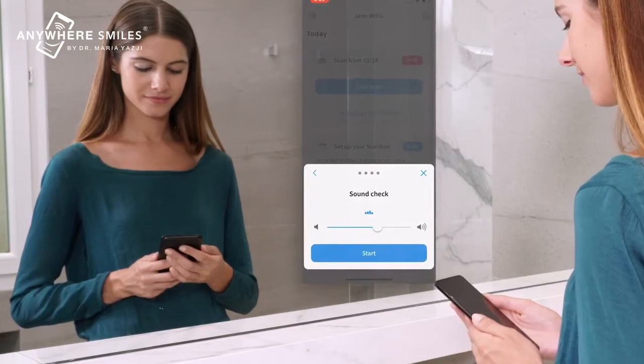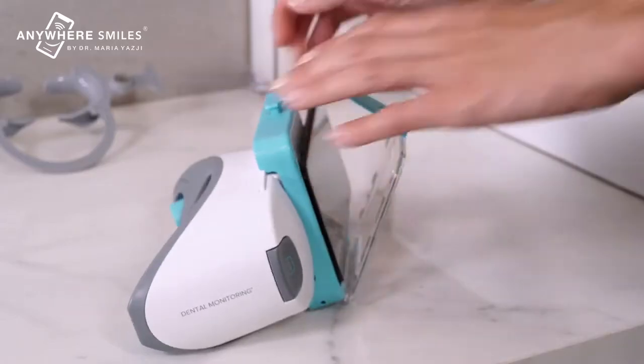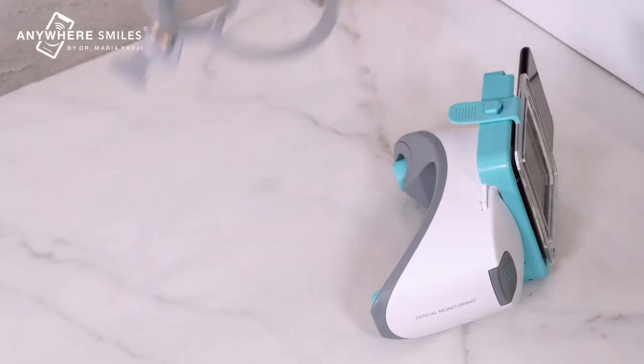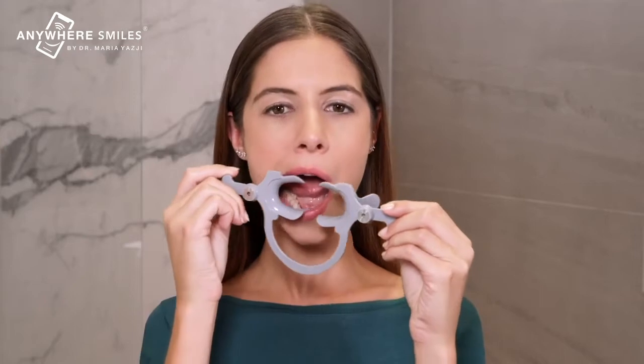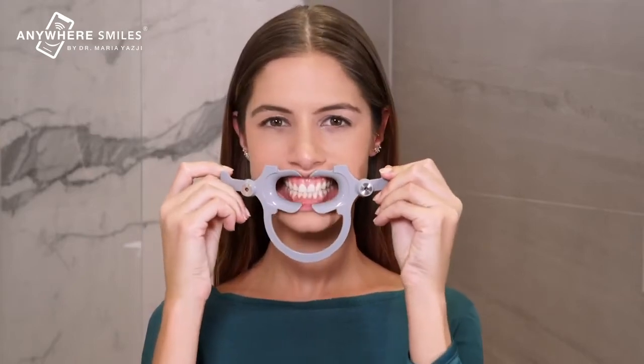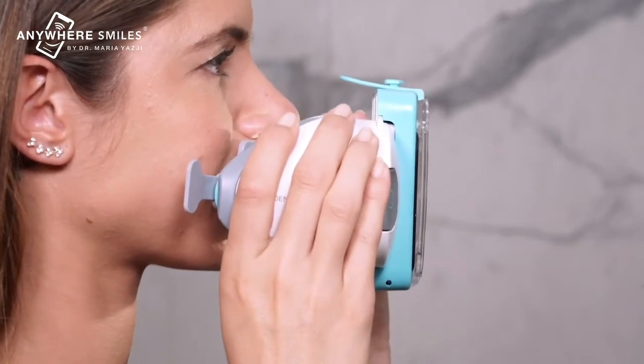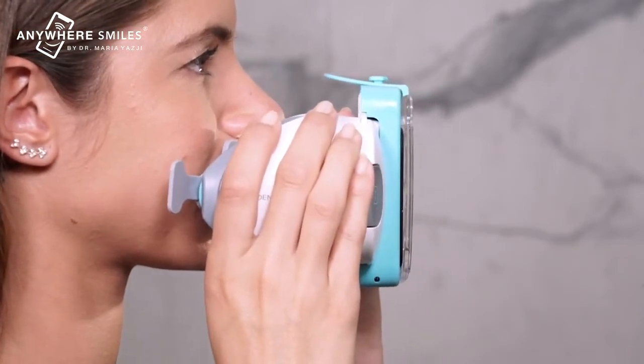Unmute your phone. Place your phone into the ScanBox and latch it in. Insert the cheek retractor and snap the ScanBox into place. Position the arch downwards. Insert one side first, then the other. You will hear a click when your ScanBox is properly attached to your retractor.